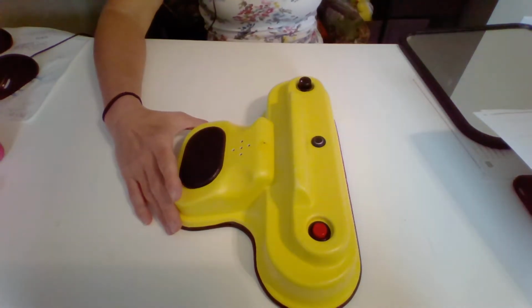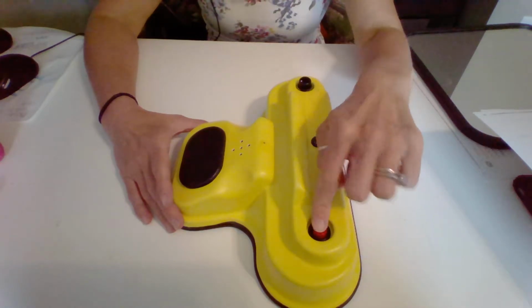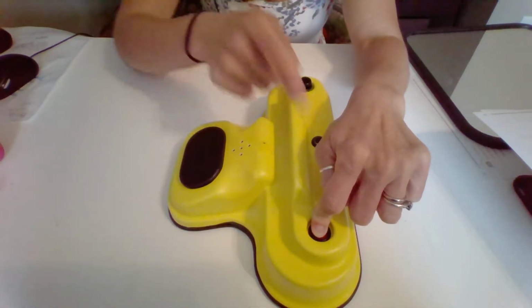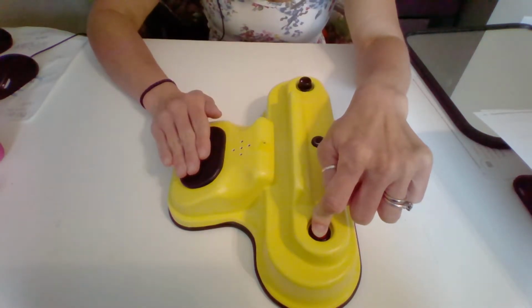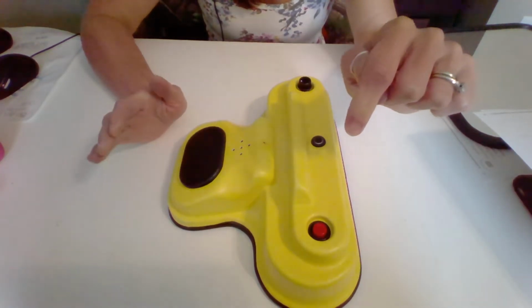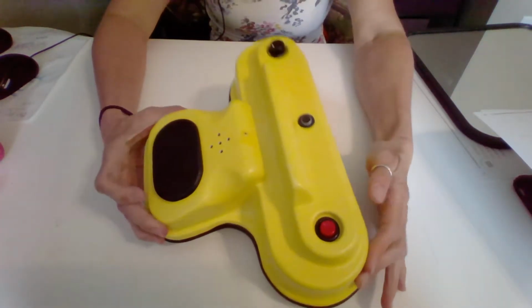So let's give it a try. I'm going to hold down the red button, red for record, remember? Now I'm going to keep this pressed down, and I'm going to press down here as well. A says ah, and also A. So when I'm done, I let go, and then that should have recorded my voice. Let's listen.